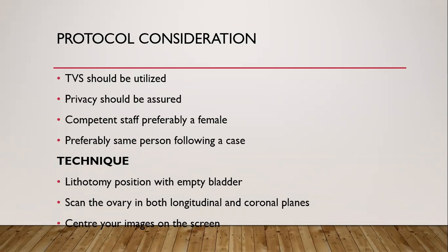We need to ensure that the staff that gets to see these mothers is as competent as possible. We don't want a situation where the mother is told that the follicle is measuring this, and at the end of it all, you realize that the measurements were gotten at a wrong angle, and they increase the dosage, which will eventually lead to other complications.